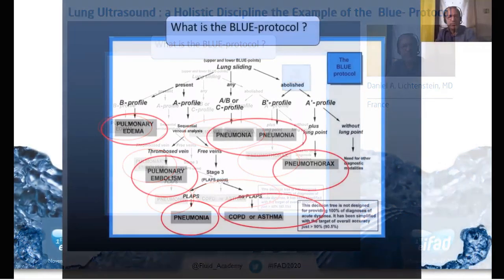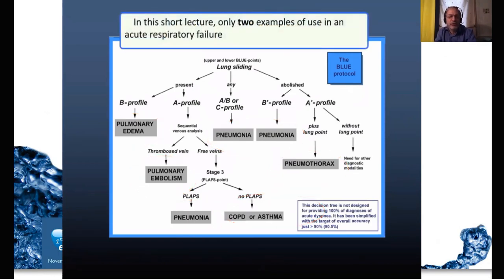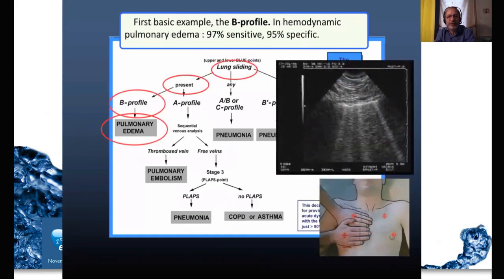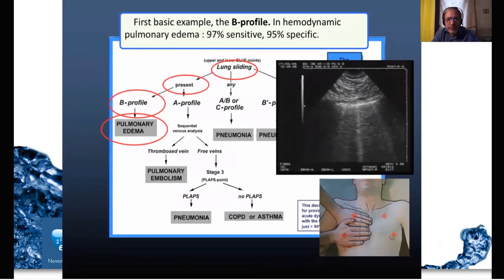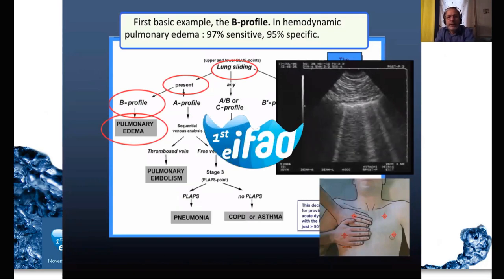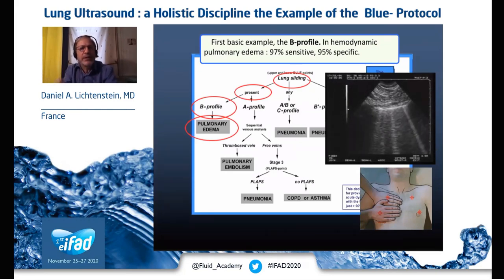These are the diagnoses where we apply the BLUE protocol. In this short lecture we give two examples of holistic use in acute respiratory failure. Here we see the B profile — that is, lung rockets with lung sliding at the anterior chest wall.